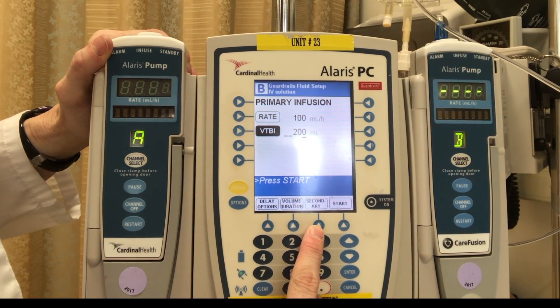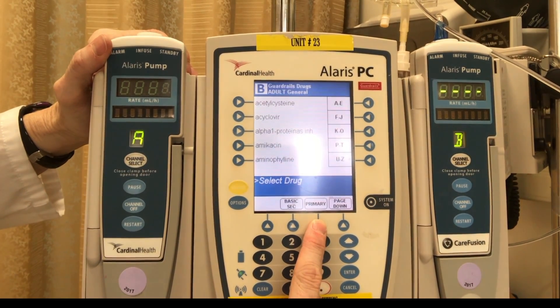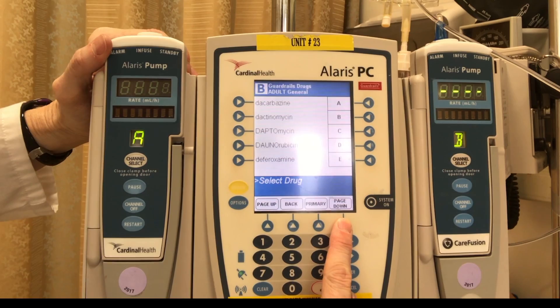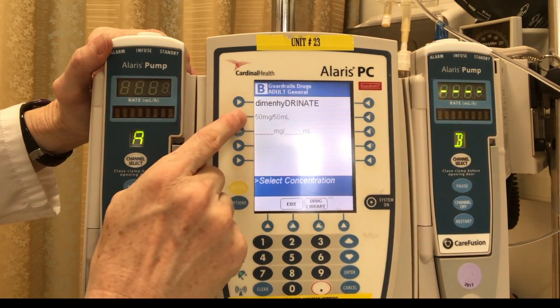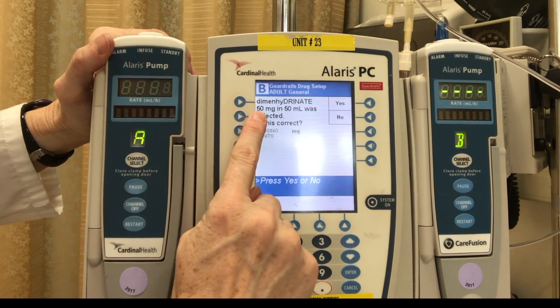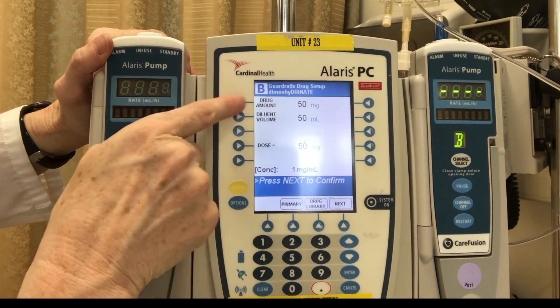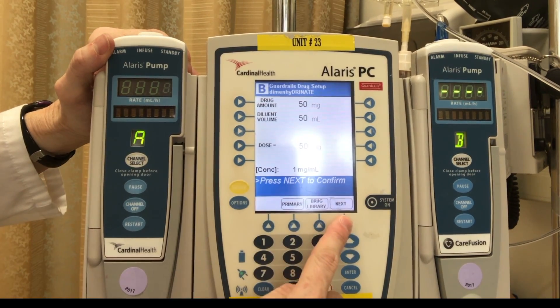Down here is where I can set my secondary bag. I have dimenhydrinate — we can look by generic name and page down. Dimenhydrinate — I can select it: 50 milligrams in 50 mils. Yes, that's what I have so I'm going to select this one. 50 milligrams in 50 mils of dimenhydrinate was selected — is this correct? Yes. It now confirms I have dimenhydrinate, 50 milligrams in 50 mils, one milligram per mil. I'm going to press next to confirm.